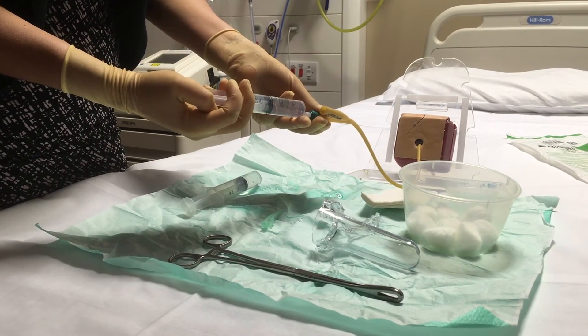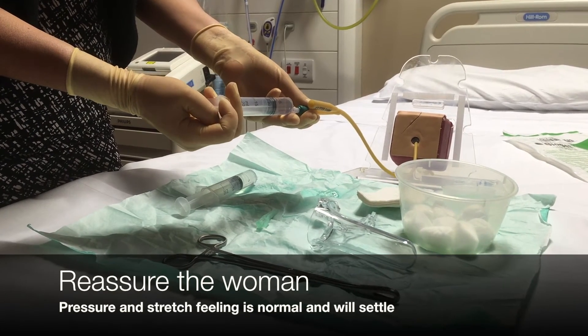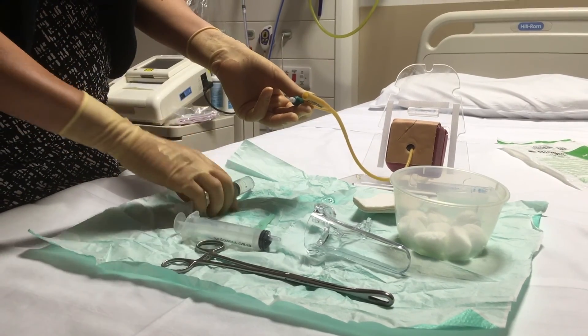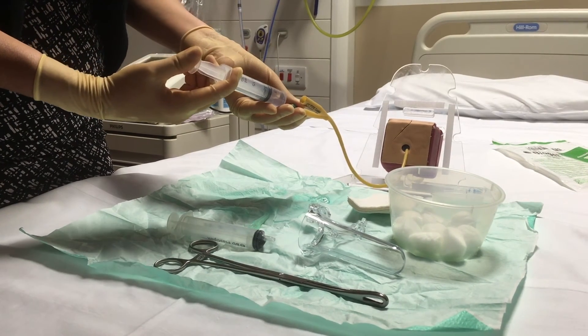At this point the patient might experience some discomfort due to the stretching while the bulb inflates. You can go ahead and reassure the patient that this is completely normal and will stop shortly. I'm just going to insert 30ml of sterile water here.